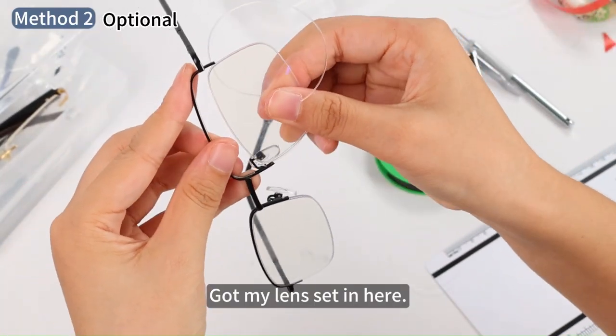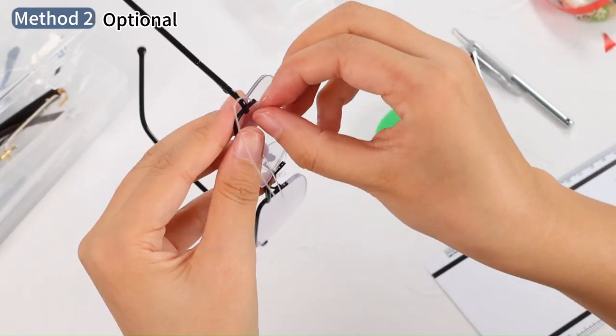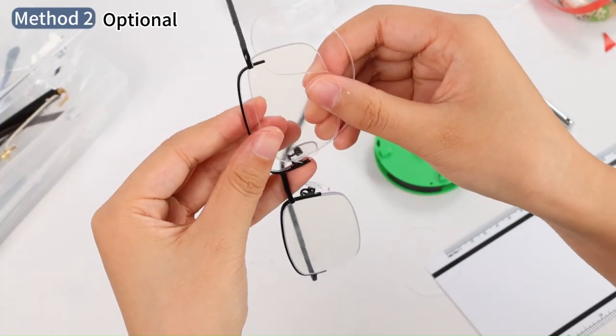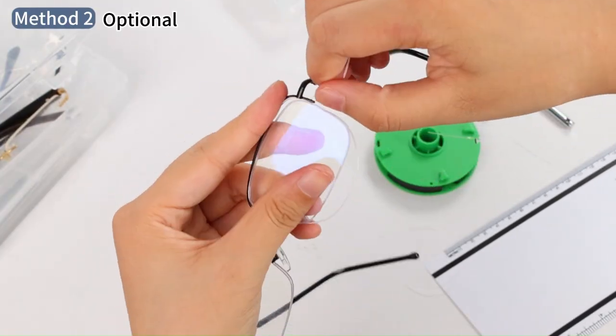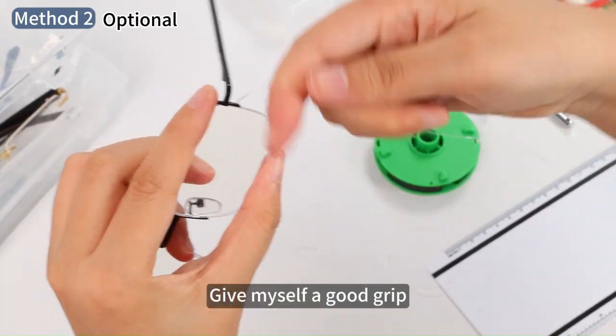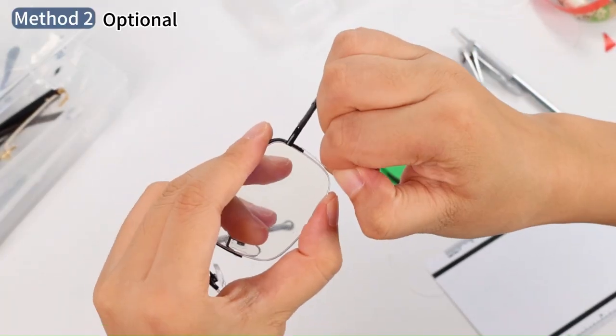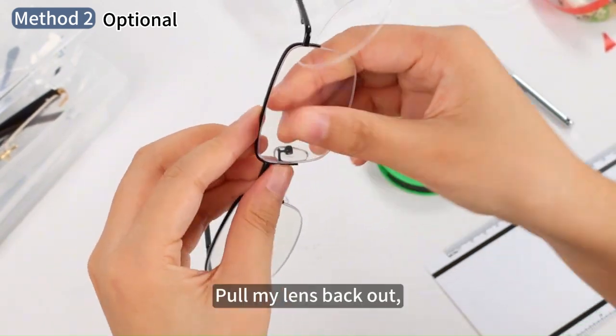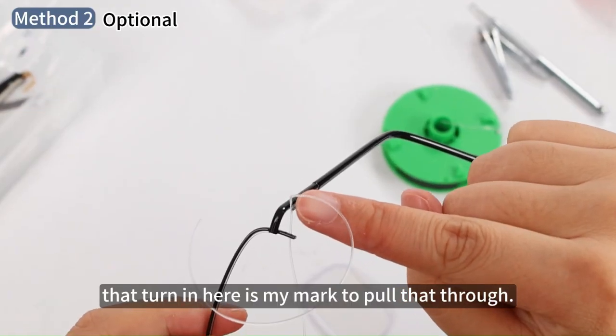Got my lens set in here. Give myself a good grip. Pull the extra string tight and tug it a few times. Pull my lens back out. That turn in here is my mark to pull that through.